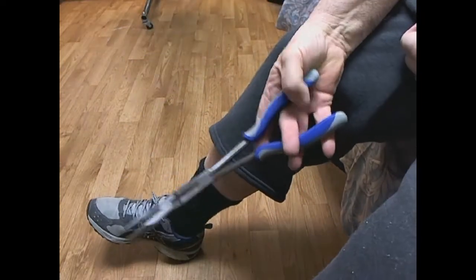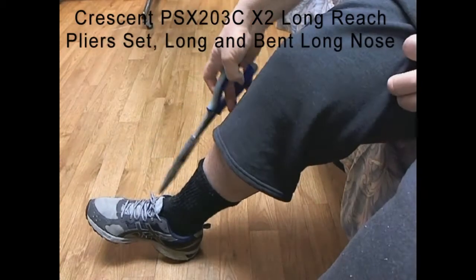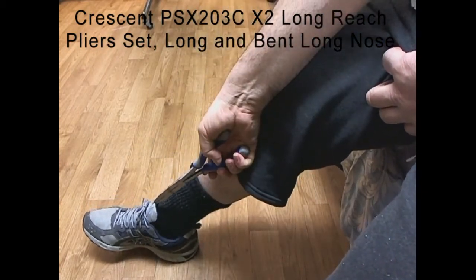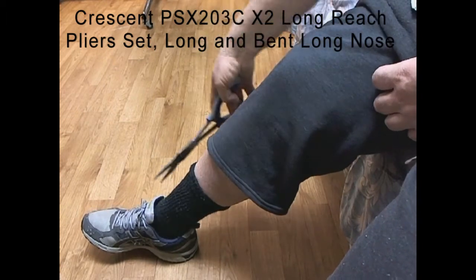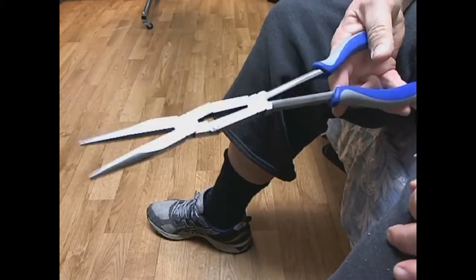So you take the handy dandy super long needle nose pliers, and you use that to pull up there. Did you see that came up about 1 inch? And now it's a lot more comfortable, and it's not quite as tight. These are essential for putting shoes on.